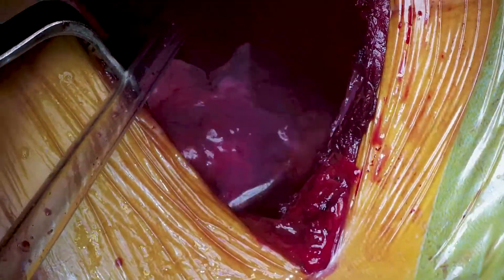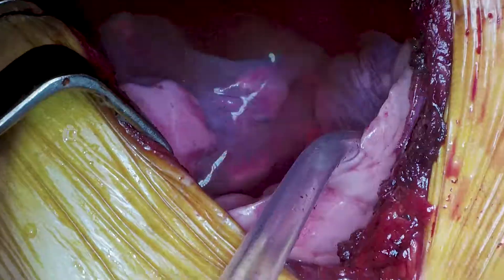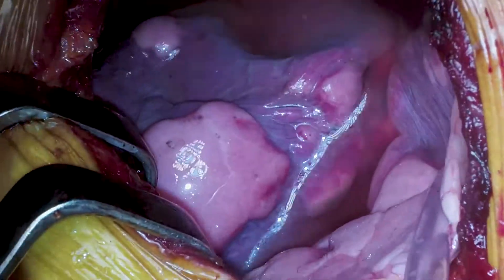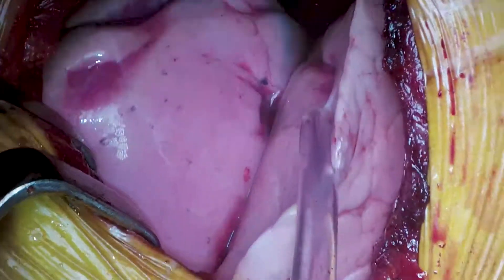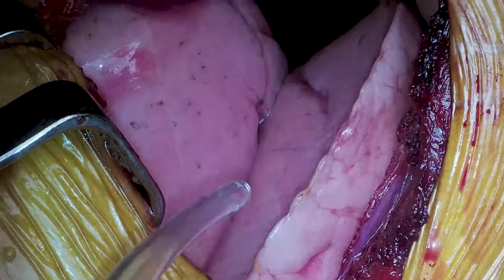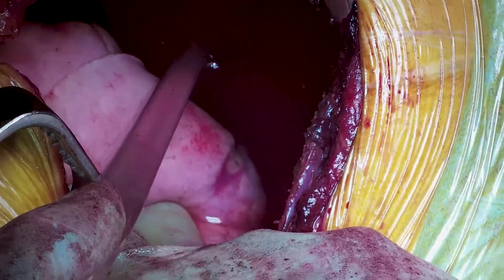We put some water into the chest cavity and perform an air leak test — getting the anaesthetist to inflate the lung and checking for any bubbles from the middle and lower lobes. If there's any bubbling it indicates an air leak, but we can see there's nothing going on. It's all fine, so we can suck the water out and begin to close up.